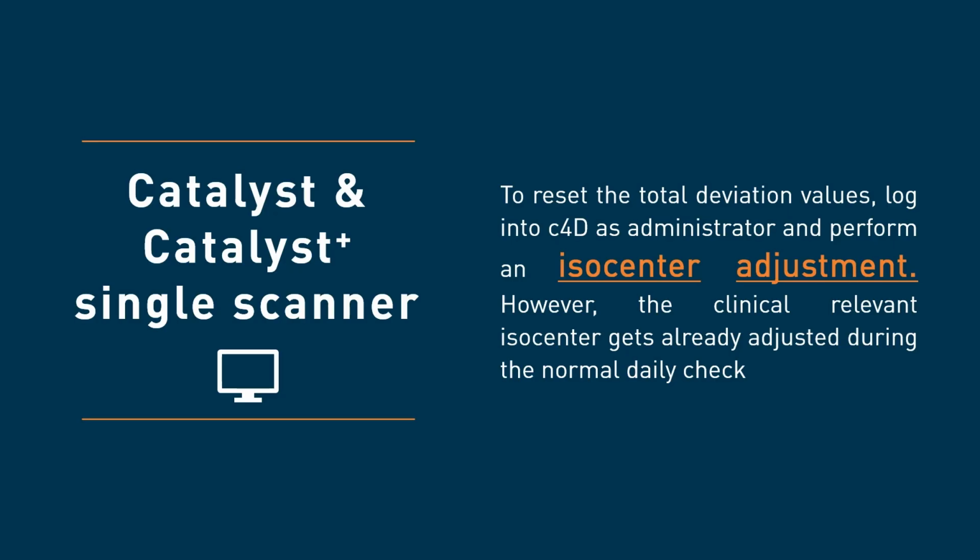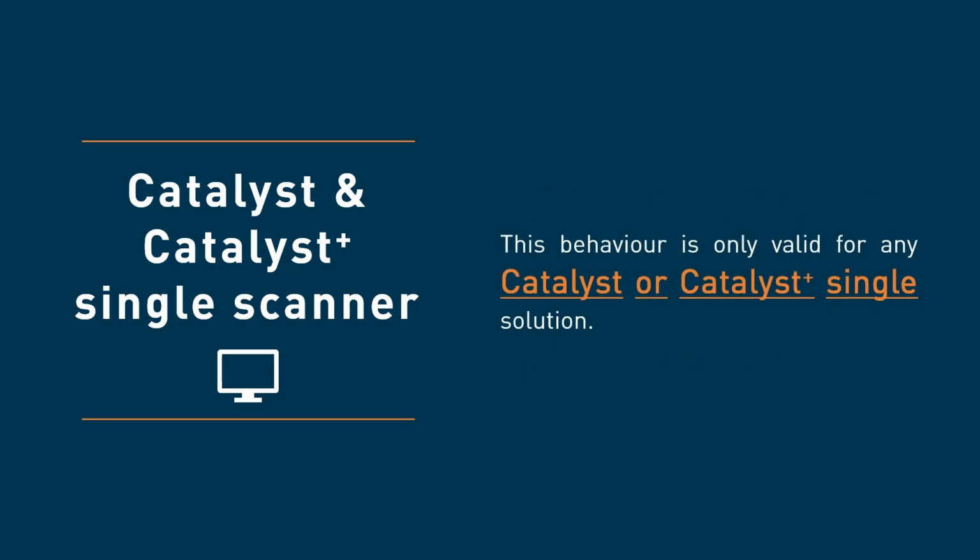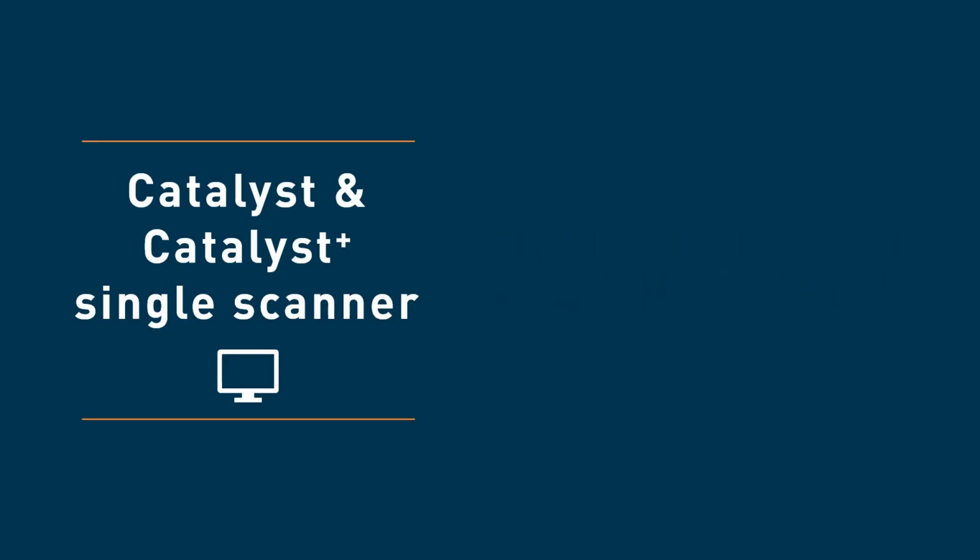This QA behavior only applies to Catalyst single solutions, where we only have one Catalyst scanner installed. For all Catalyst HD systems, instead, once the routine QA is activated, the QA behavior changes to the one we have discussed mainly in this video.